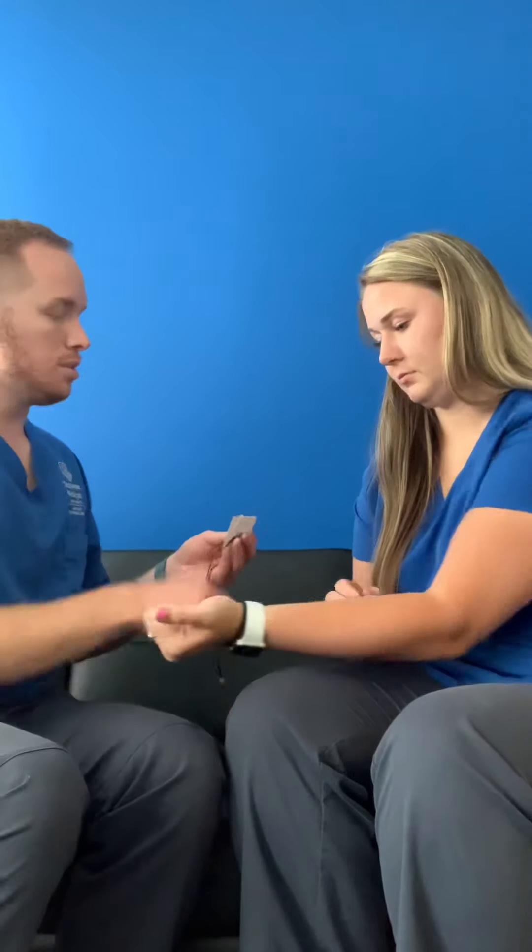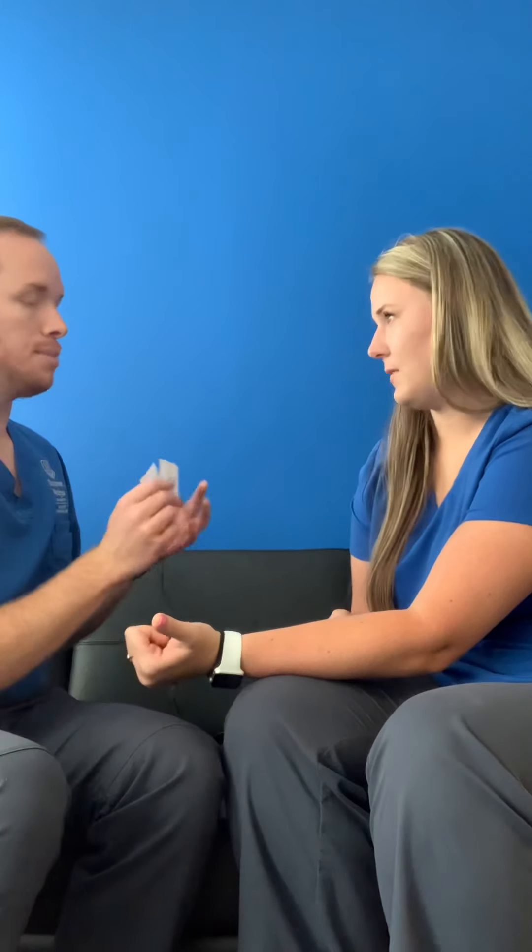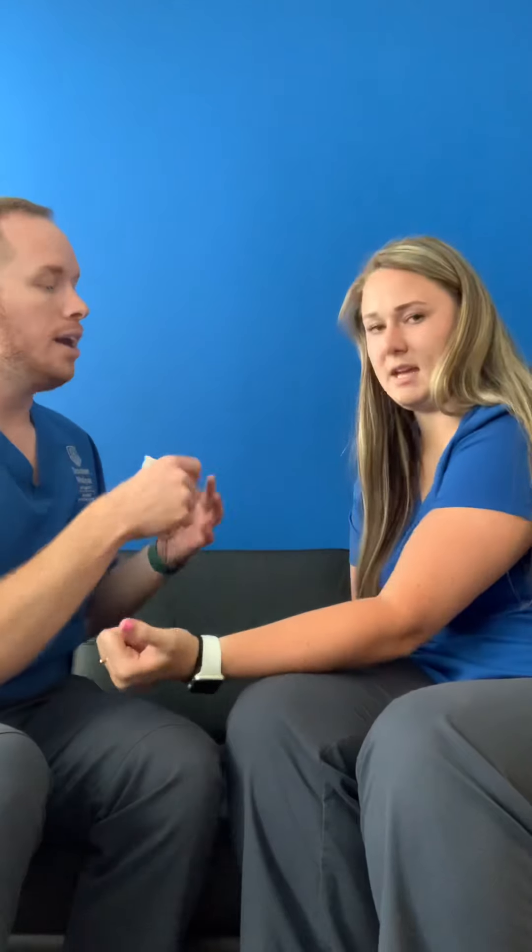So I'm going to place these pads which are called electrodes. Now you don't have any type of brain stimulator or pacemaker or any electrical implants? I did see in your chart you did not, so I just wanted to verify. And you don't have any swelling here, so that's good.